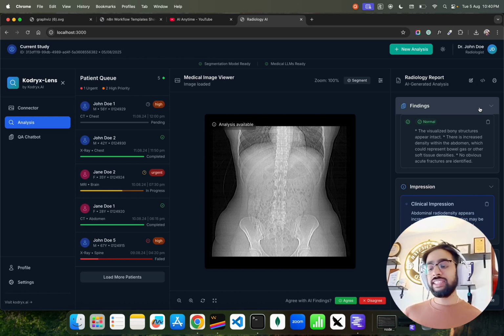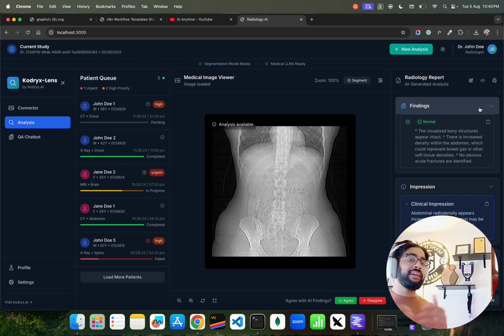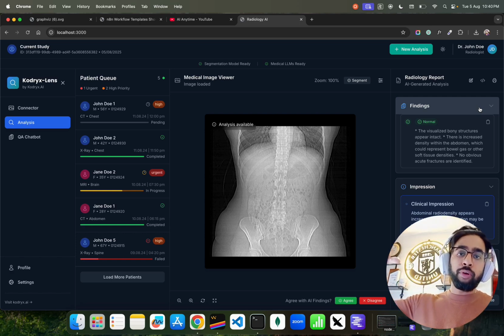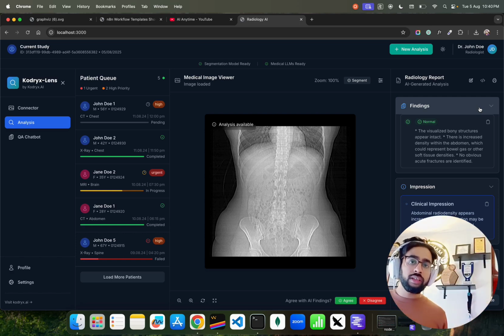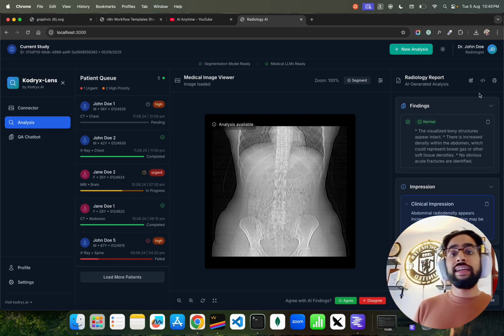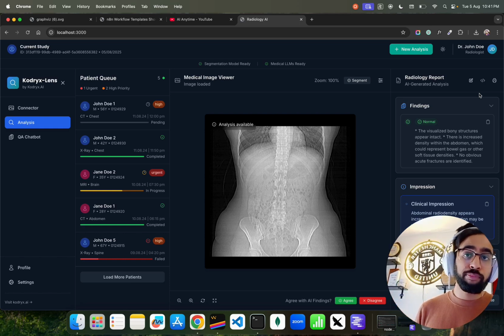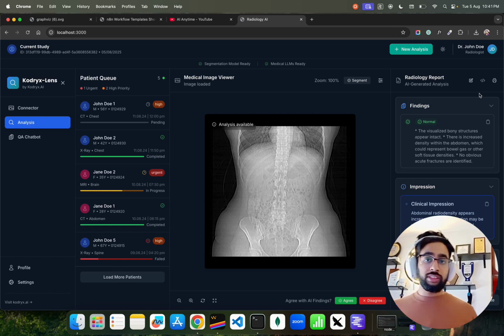Now, here the question is, this is fine because this is an external interface, right? How does this interact from the data input to the output, the output that has been generated? So mostly what happens is when we are working with the bigger hospitals, or mainly in the healthcare industry, these kinds of systems are integrated with the EHR or the EMRs of the world, electronic health record or electronic medical record, like Epic, for example, Cerner, for example. There are a lot of others, Athena, for example, and so on and so forth.